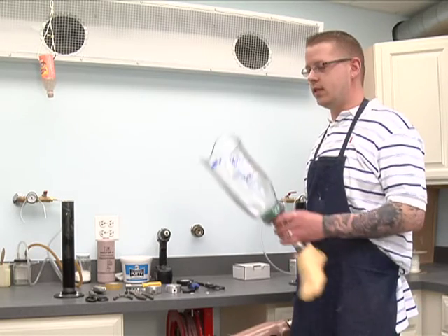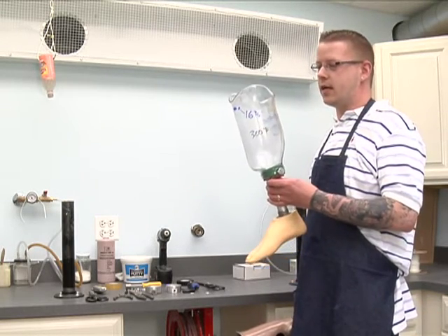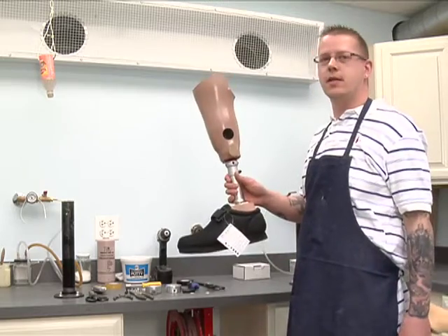Hi, my name is Tony and on behalf of Expert Village, I'll be showing you how to turn this check socket into a laminated definitive prosthesis.